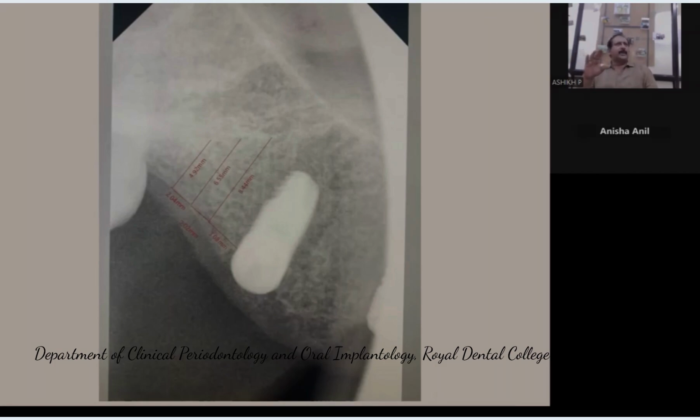So up to 6 millimeters of drill is possible, but confirm with your first lance itself how many millimeters are possible beyond it. If you can comfortably go up to 6 millimeters, go up to 6 millimeters. So you have reached a position of 6 millimeters. Thereafter, if you want to increase the length of the drills which you have placed, you are at risk.